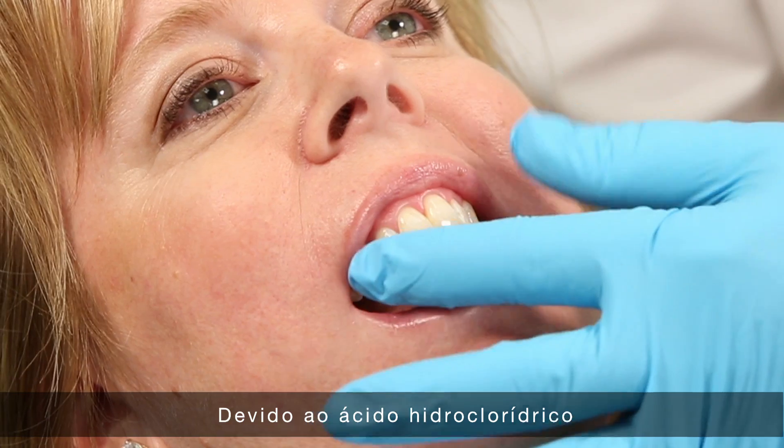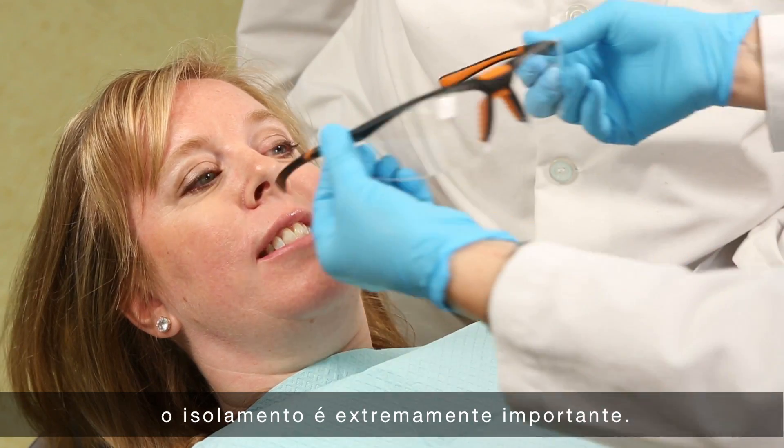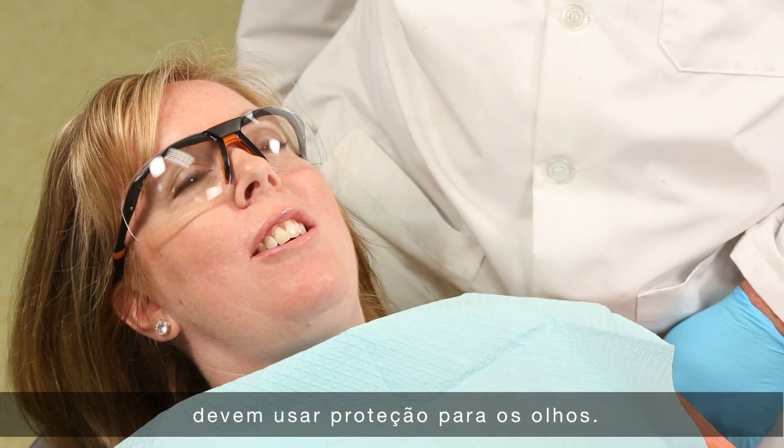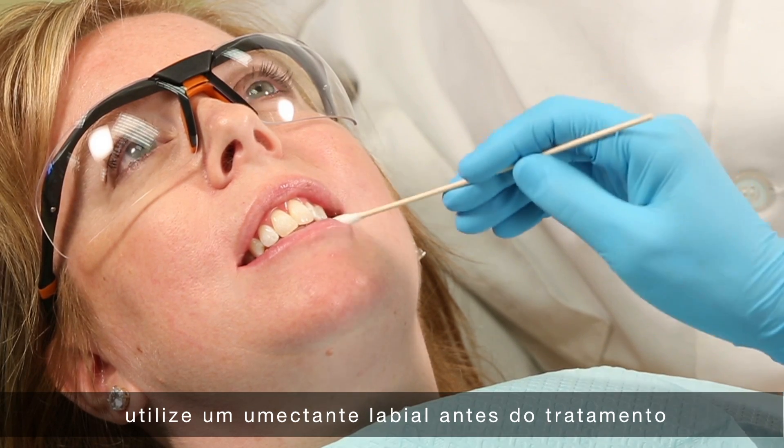Because of the hydrochloric acid contained in Opal Luster, isolation is extremely important. Both you and your patient should wear protective eyewear. For additional patient comfort, apply a lip emollient prior to treatment.